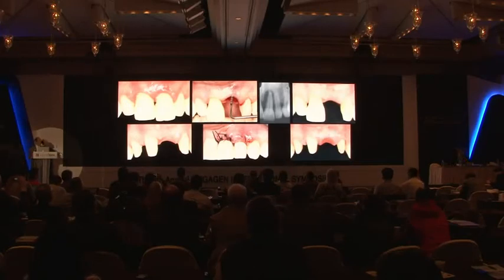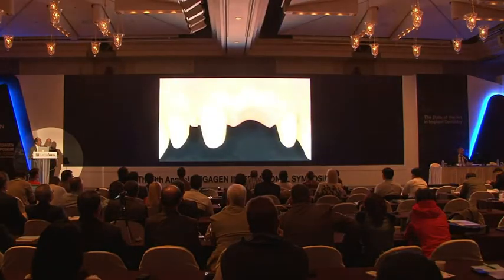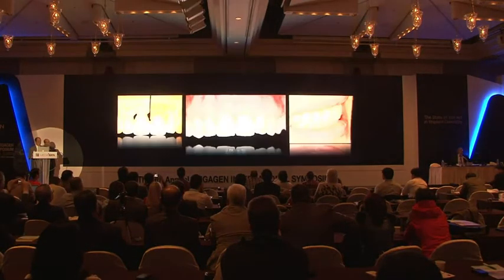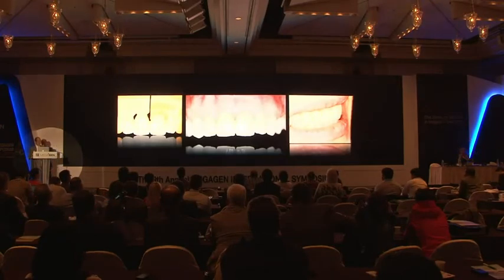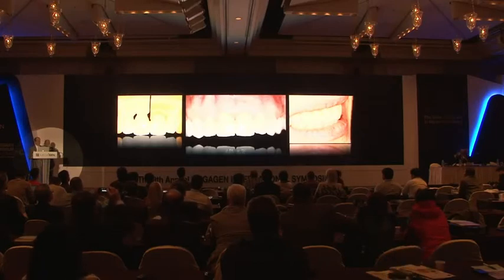We worked on the tissue with an epithelium connective insertion, and we had a good result, as you can see in this slide. The final prosthetic restoration made the patient very satisfied, and the result was achieved because we knew the guidelines on how to work on natural teeth. As we are going to see in the next slide, this result depends on the marginal fit of the crown, which must be extremely precise.